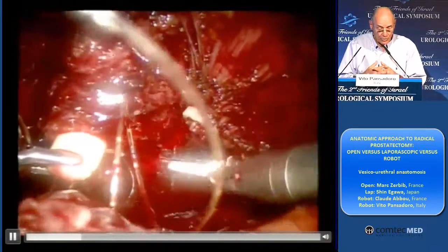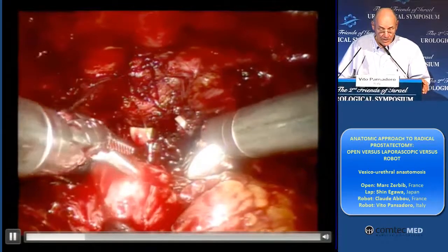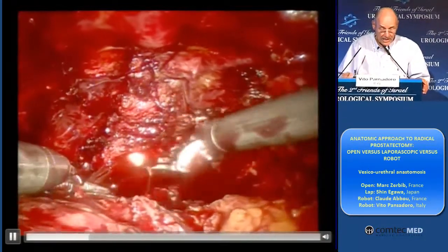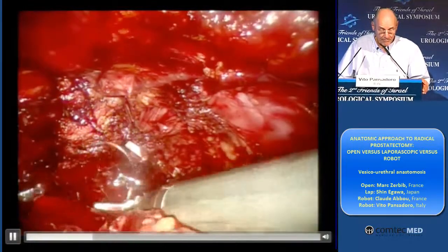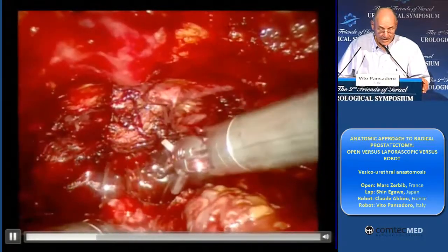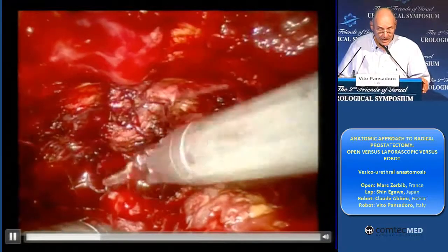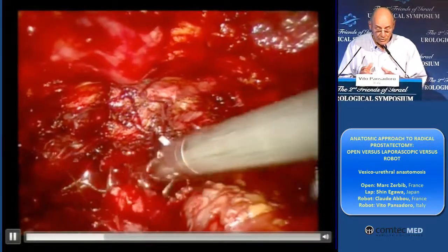And this produces that the two structures are very near, and it's very easy to do the anastomosis then. And then we do another layer between the lumen of the urethra and the lumen of the bladder neck — which, most of the time, is saved when it's possible. And you see, by pulling this thread and pushing a little bit gently on the bladder, we bring the two structures together.